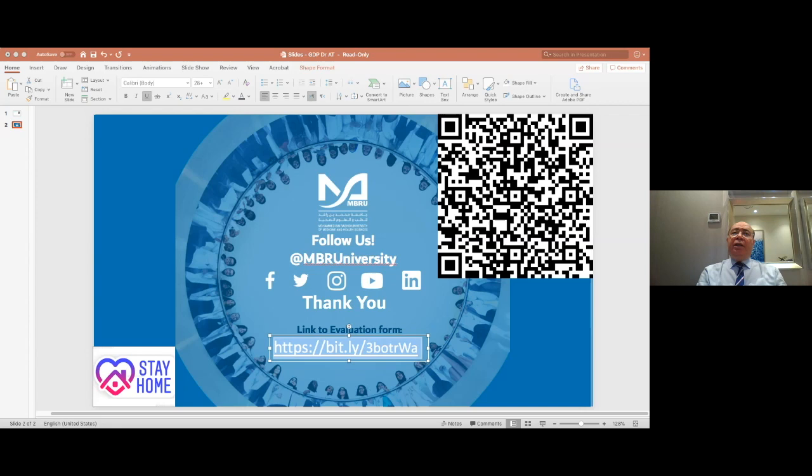The whole idea is creating a gutter, a path, a groove to guide the canine to where it's supposed to be. If the canine is too close to the lateral incisor or too far palatally, and as I mentioned the bone is too thick, it will take ages for the canine to come into place. Also, if it is very close to the lateral, you need a way to guide it. So when you expose the canine and you know exactly where the position is going to be, you create a groove with your bur or the piezotome, and through that groove the traction by the orthodontist is going to happen. As simple as that. Thank you, Doctor.